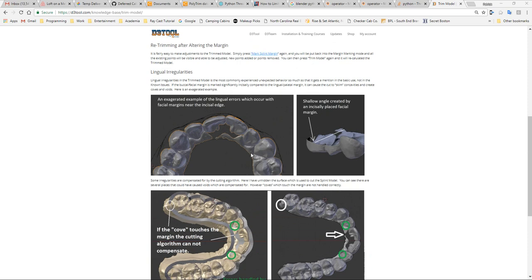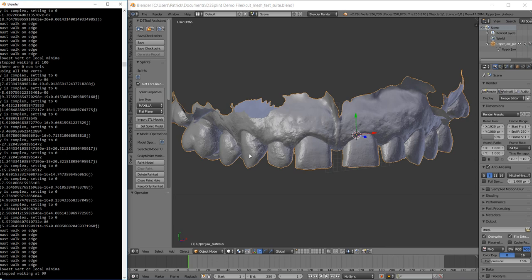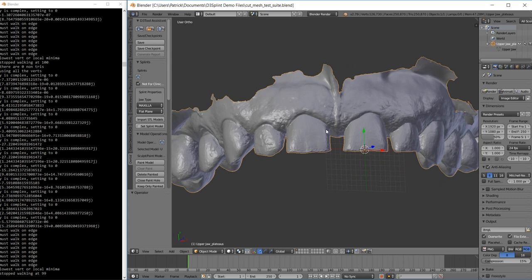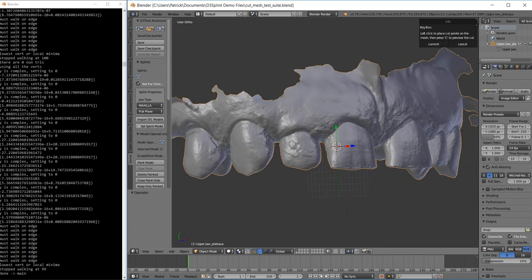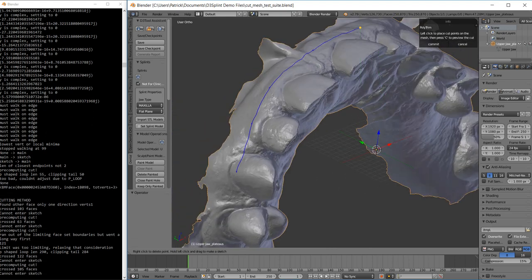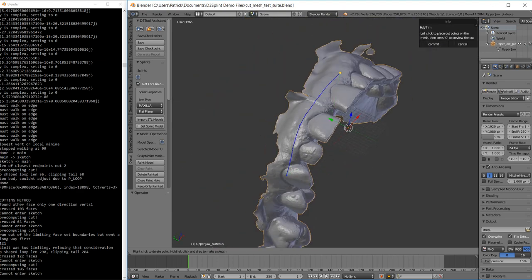So I've been working pretty heavily all summer on the core function that is going to drive the new margin marking, which is really just an extension of a mesh cutting algorithm. This is going to be used in probably all of our future tools in some form or another. There aren't too many workflows that don't involve some kind of boundary marking. So the first thing we're doing is, what you see is what you get. The cut is calculated on the fly.